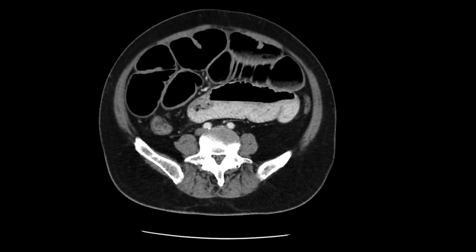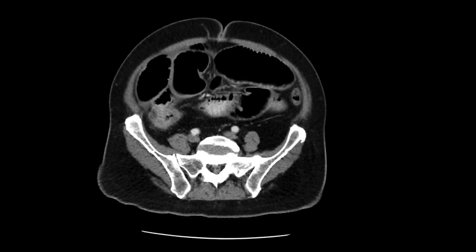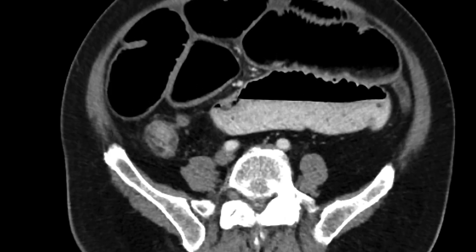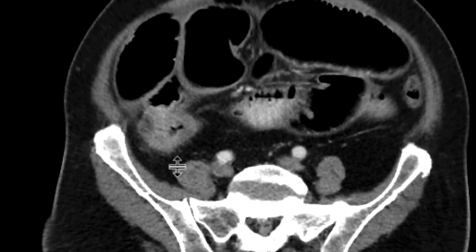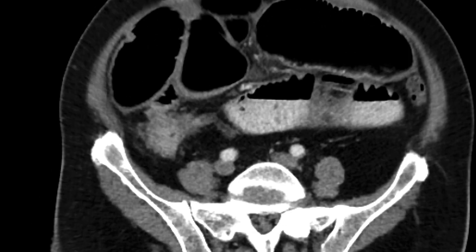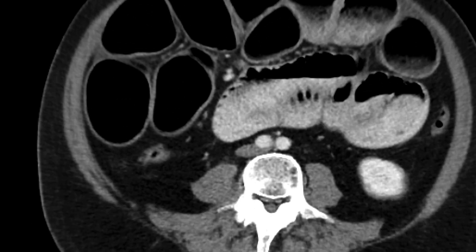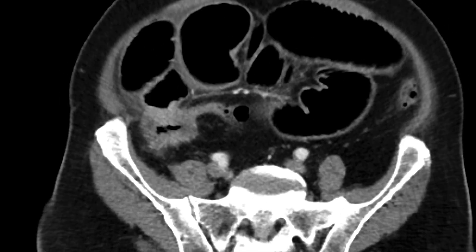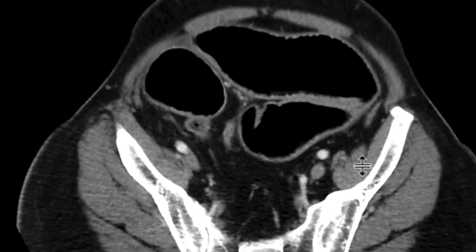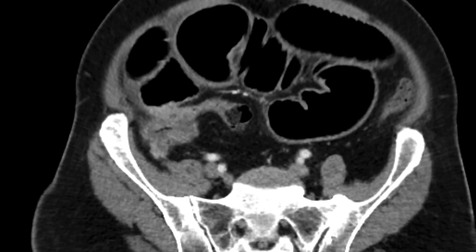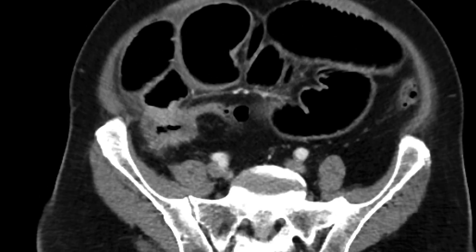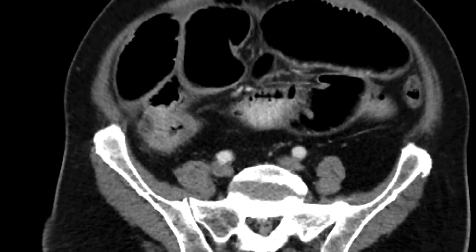So where's the level of the obstruction? As you scroll down, we can see there's something going on in that right lower quadrant. Look at that cecum over there — very, very thick-walled. The ascending colon beyond it is absolutely collapsed. And it's interesting in that the ileum, you can see, is all the way distended, and right around where it joins the cecum, that terminal ileum, is where the level of obstruction is.